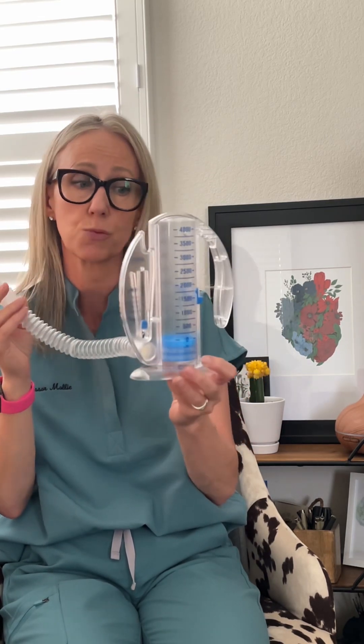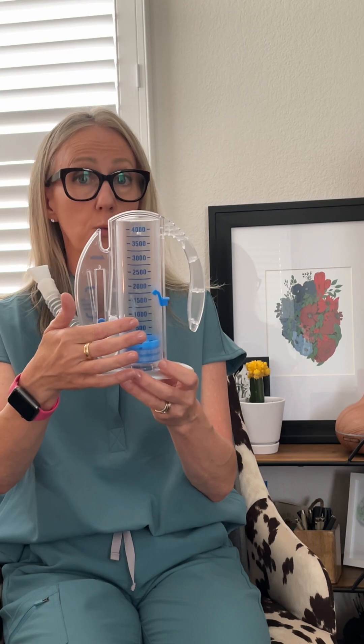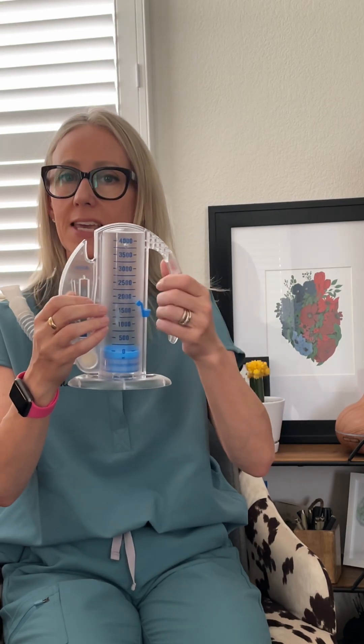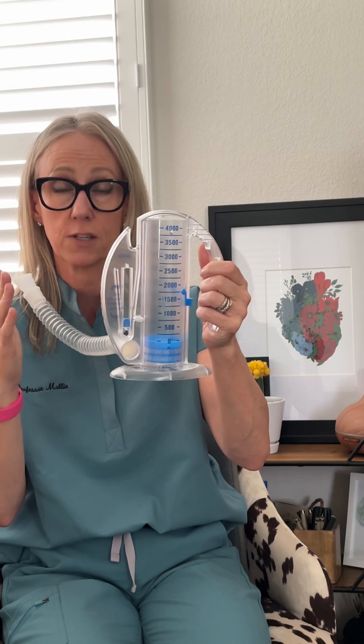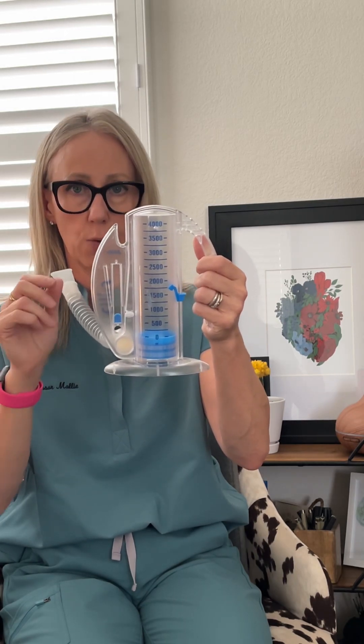For those who can do this, it's really important that they create a tight seal and take a slow, deep breath in, watching the toggle rather than how high the indicator goes. As they improve their technique and do this 10 times an hour as directed, they'll slowly start to increase how high they can get it. Let me show you: take a normal deep breath out, and then inhale slowly, keeping the arrow between the bracket in a slow, controlled manner.